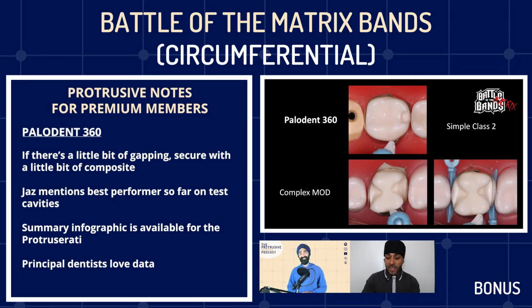Yeah, indeed. So back to the cons of this, right? Because again, everything has a downside. The matrix itself, one of the reasons I think it adapts so well is because it's thin.